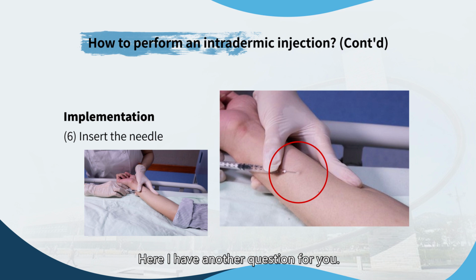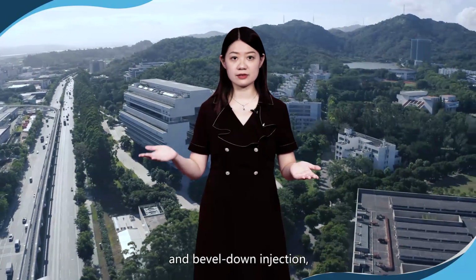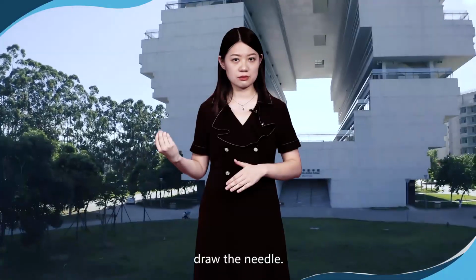Here I have another question for you. Why do we need to keep the bevel up when we insert the needle? Yes, it allows for smooth piercing of the skin so that we can inject easily. In fact, if we search for the evidence of bevel up and bevel down injection, we found that different studies show different results. Most articles show that bevel up is more comfortable and significantly faster, while a few reports state the opposite. Thereafter, you will withdraw the needle.